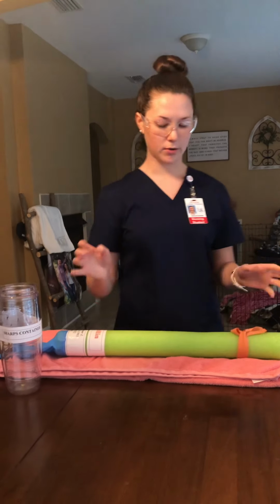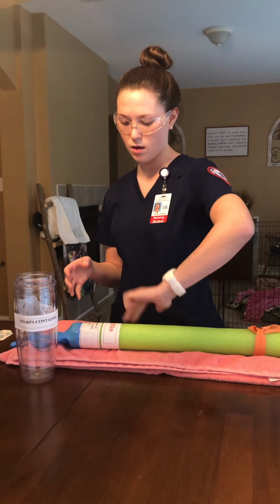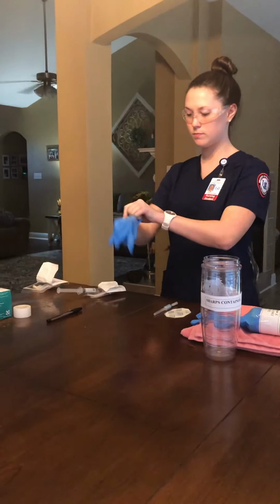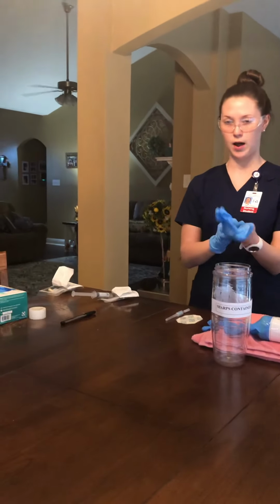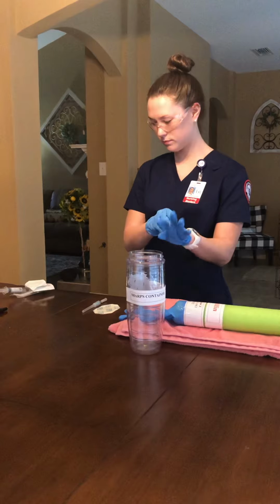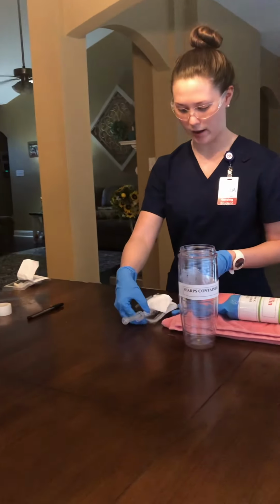So once that is done, I'm going to assess the vein for appropriateness. I'm going to check the radial pulse. And once I do that, I'm going to want to apply my clean gloves. And then I want to move my saline lock closer, maintaining sterility of the package.